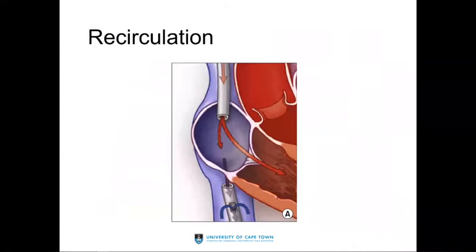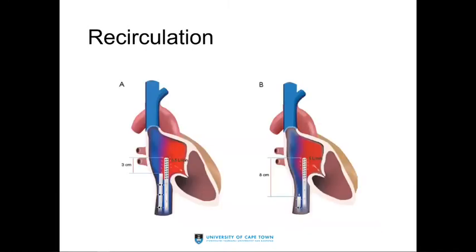The other thing to just be aware of, if you're maybe not meeting your oxygenation requirements with ECMO, is to know that your cannulas are not too close together. Because in the VV configuration, if you suck out the blood that you just returned with the machine, you're actually sucking out oxygenated blood before the heart's had a chance to take it around the body and the body use that oxygen up. And you may recirculate and your system may not be as effective. So you need a degree of separation between the cannulas.